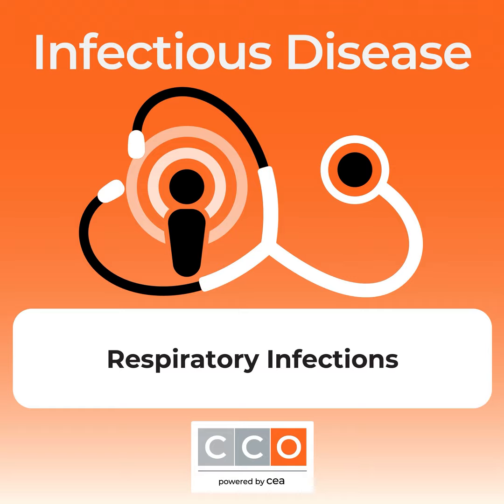So that's where the addition of this information that detected, say, a virus and no bacteria made clinicians feel more confident in not using antibiotics. Another important feature is that the quicker these panels gave results, the more likely they were to lead to a decrease in antibiotic use. This is one particular randomized trial, and I think it highlights one important point. It was done as a point of care syndromic test versus standard test, and 360 patients who are presenting with an acute respiratory tract infection to urgent care.